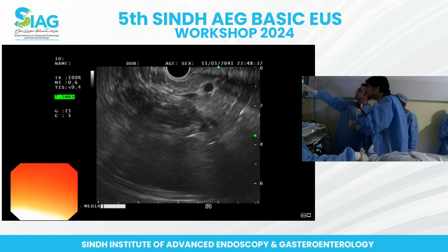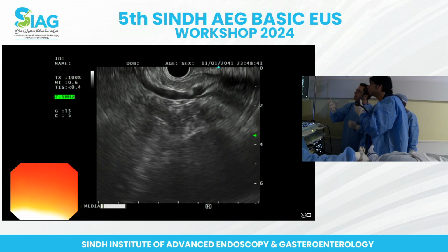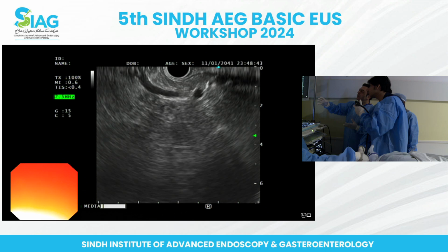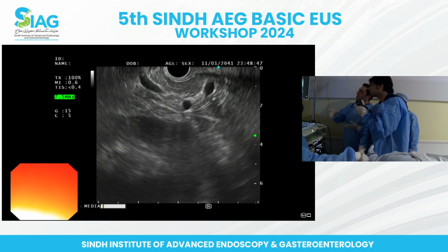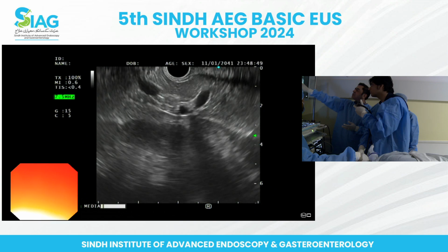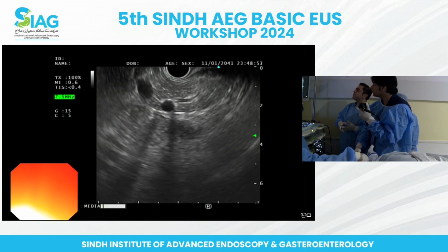So the splenic vein is at the bottom. It's a bit compressed, can you see? If you take away the pressure on the vessel, can you see there how it opened up because of the pressure? So that's the splenic vein. So just keep on bringing it up. That's the splenic artery. It's changing its course, yeah? Yeah, excellent. So this vessel will start to go up now.